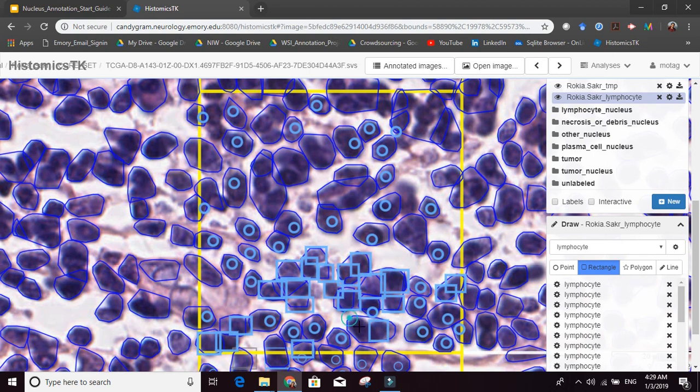Just because I'm doing all this recording, it's a little slower than it usually is. So you can see this clump. The algorithm thinks all of these are one lymphocyte, but in fact it's 3 of them. So you just break it down. You ignore what the computer does, basically, in these situations. In here, you do this, you do this. See that? There's no problem. You just do this, and then let's do this.